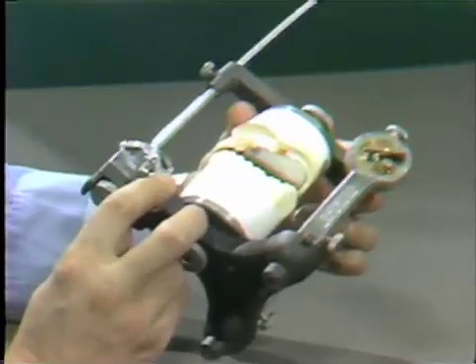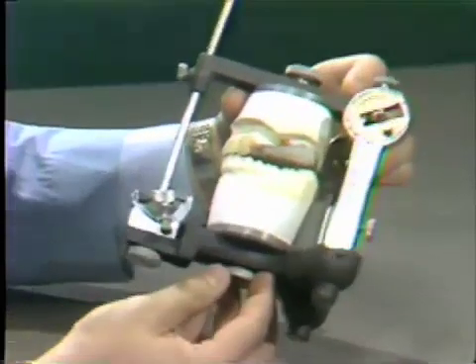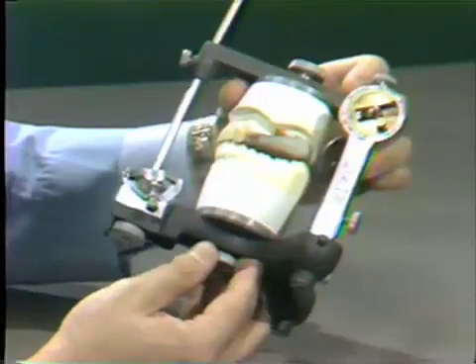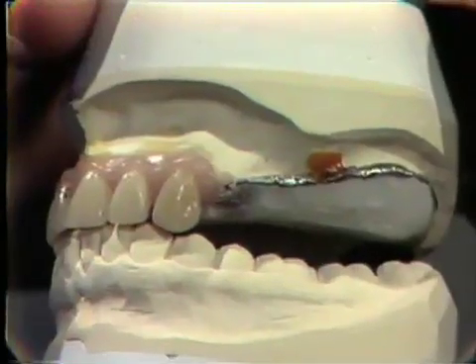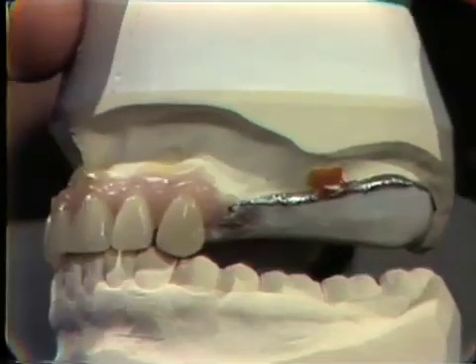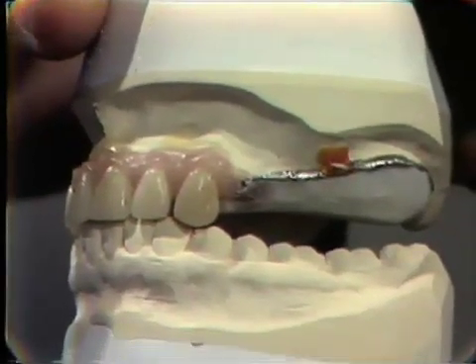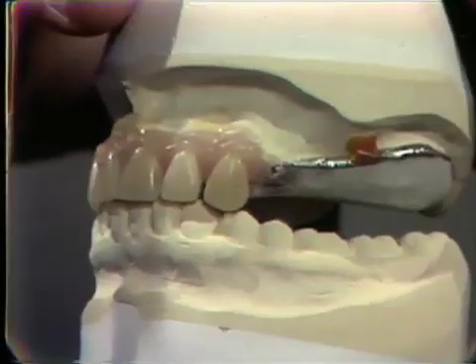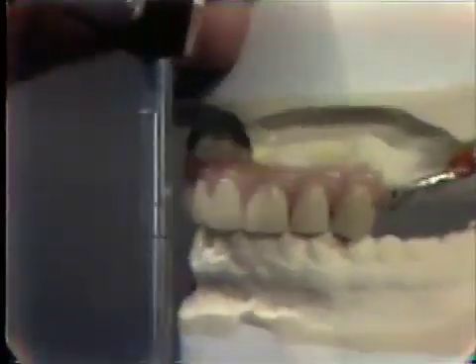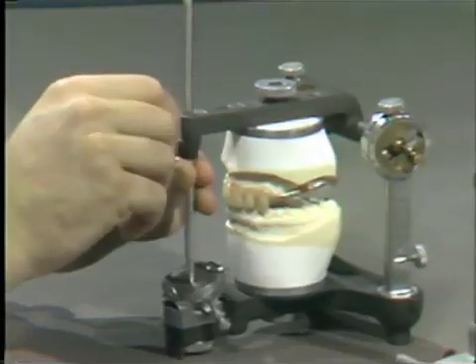For this exercise, we are using the same anterior and posterior teeth as were used in the treatment of a patient. Since the patient has natural mandibular teeth, the occlusal surfaces of the maxillary replacement teeth will need to be ground slightly to achieve proper articulation. In order to have tooth to grind, it is often advisable and necessary to open the occlusal vertical dimension by the incisal pin slightly — approximately one half of a millimeter.